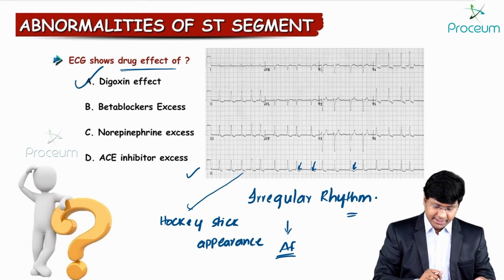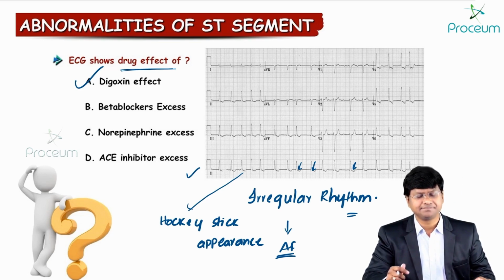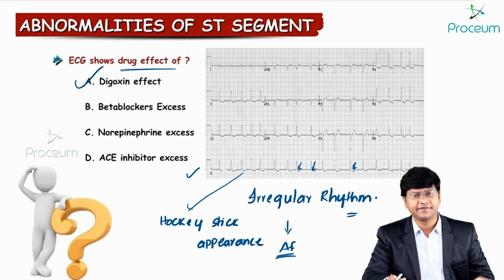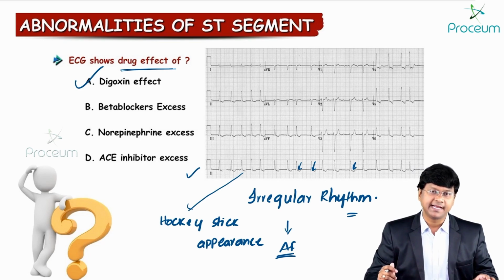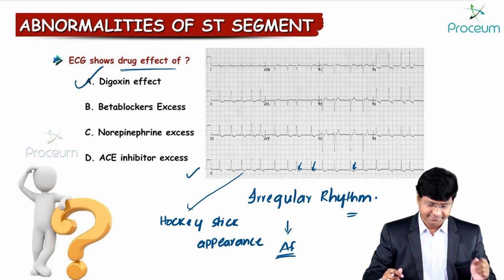Now, after having discussed the ECG showing the digoxin effect, let me show you one more ECG corresponding to ST depression, and let me tell you the diagnosis parallelly.